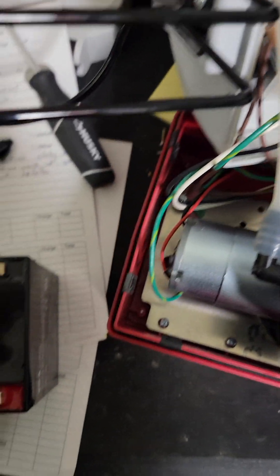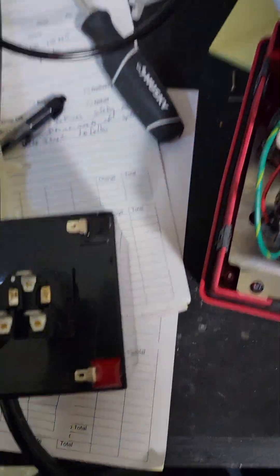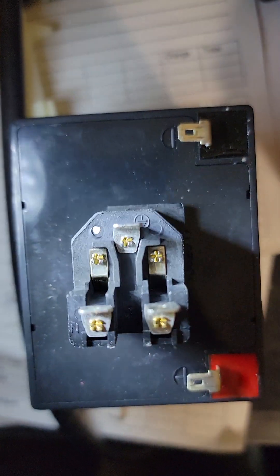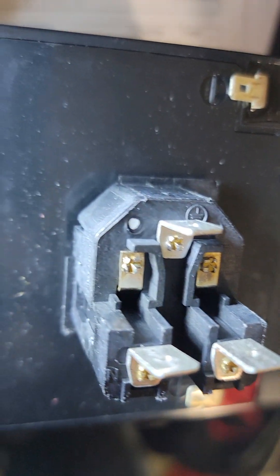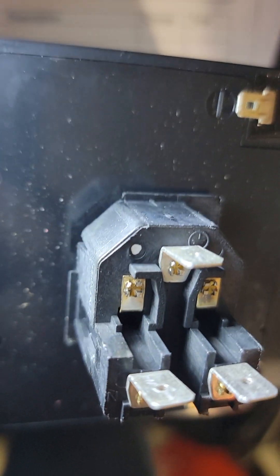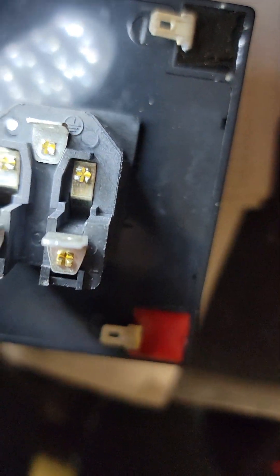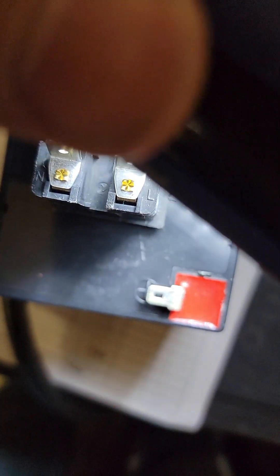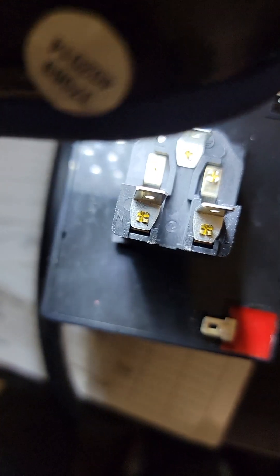We're gonna flick our power entry module back in so we can get AC power. In case you forgot which cable goes where, on the back of pretty much every power entry module you'll find a little symbol that tells you who's line and who's neutral — there's your L for your line, or your hot, and N for your neutral, or common.